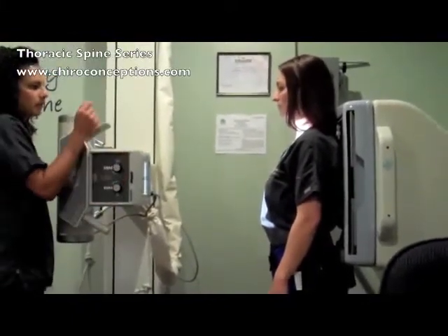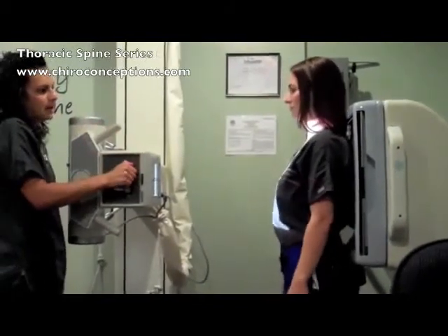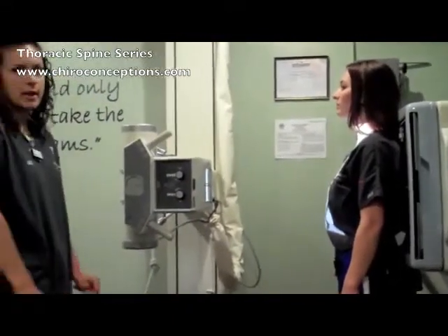Make sure the patient's centered — move it to your right, then move it to the left. Make sure that you collimate also. Let's do inspiration and holding.